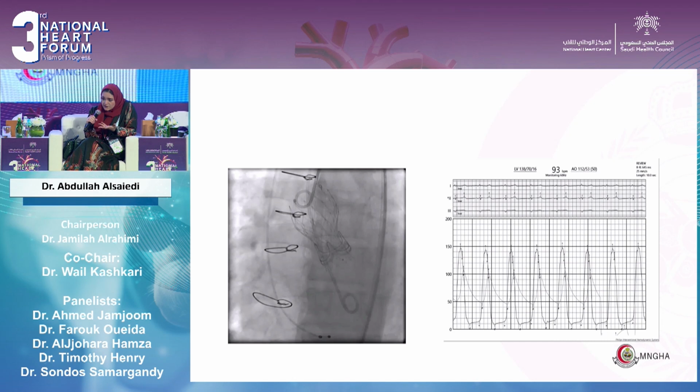So after the fracture, you can then just go and see your hemodynamics to see if you need to go a further extra step or not.